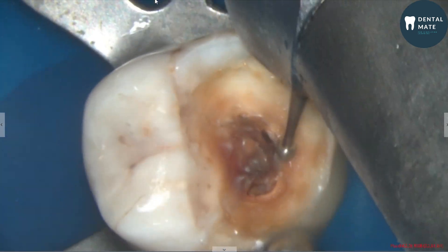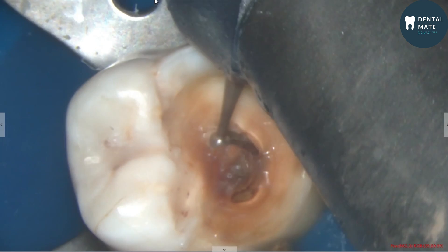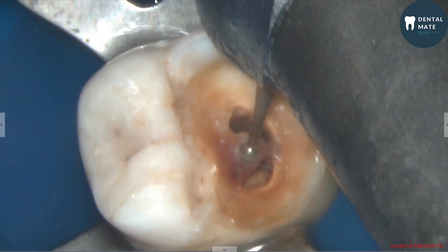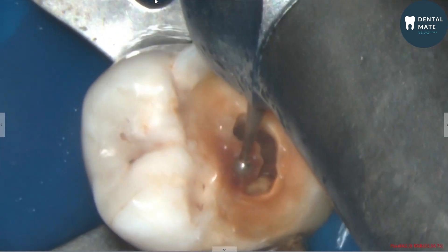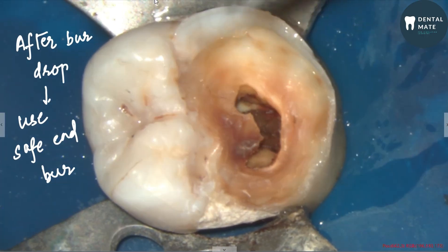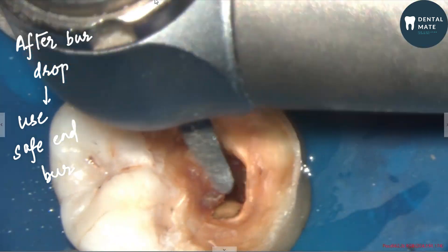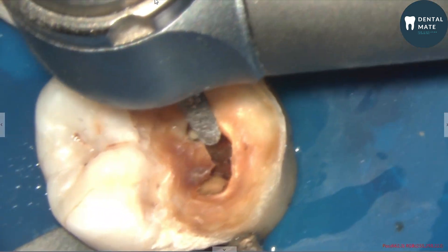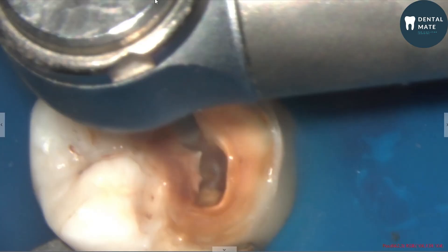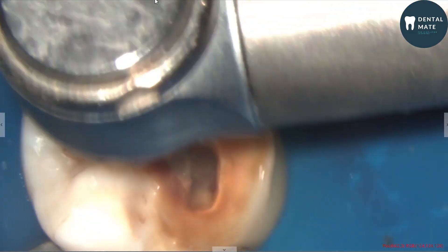Once we have removed all the caries from the periphery, we'll progress toward the center. After obtaining the first bur drop, it is advised to switch to the EX24 bur, which is the safe-end bur. We will remove all the undermined dentine and still try to make a conservative cavity preparation, preserving the soffit as much as possible.